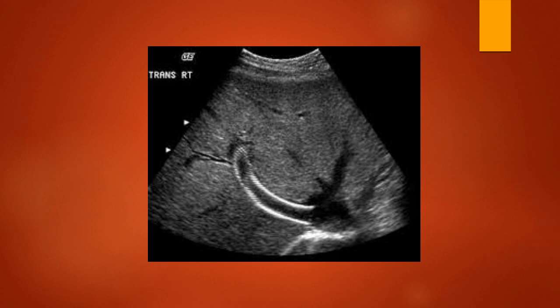So here we can see the shunt placed right in that. I believe this is probably the right hepatic vein. I think so. I think that's the middle joining together here. I'm not sure. Kind of hard to tell, but we can see that this is going to be that branch of the hepatic. And if we were to follow this, cine looping around, we would see it joining back up with that main portal vein in that region of the porta hepatis.